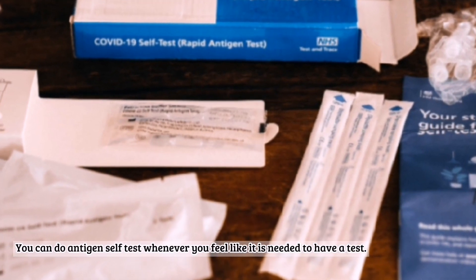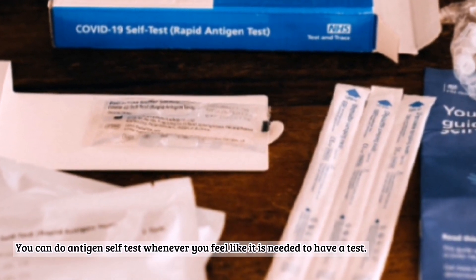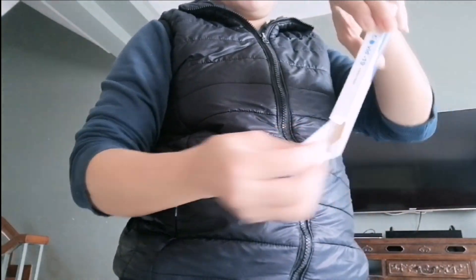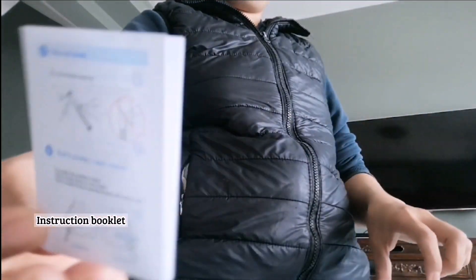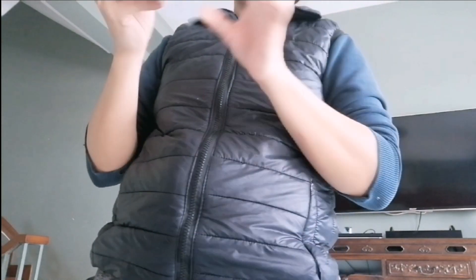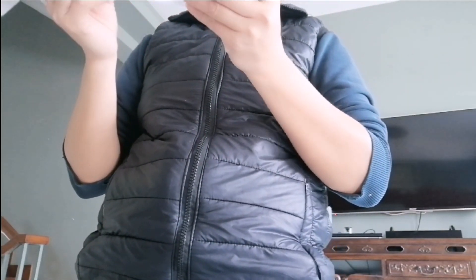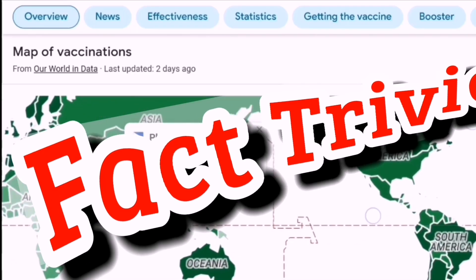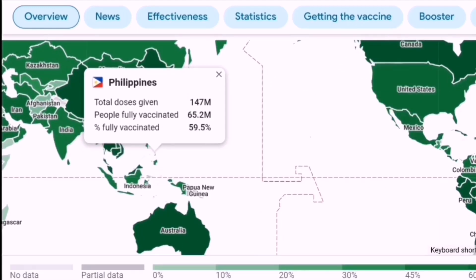You can do antigen self-test whenever you feel like it is needed to have a test. This is the instruction booklet. We are trying to comprehend what's in it. So we'll read first, and while we do that, let's have some fun trivia.